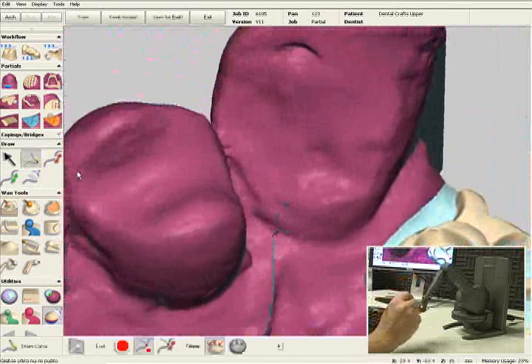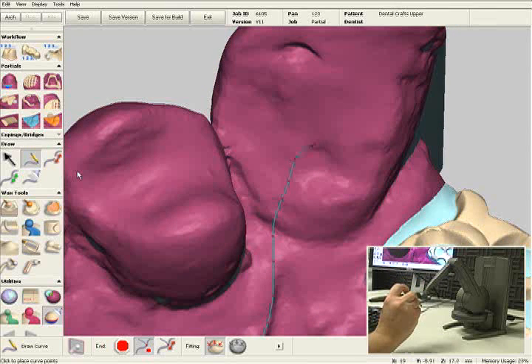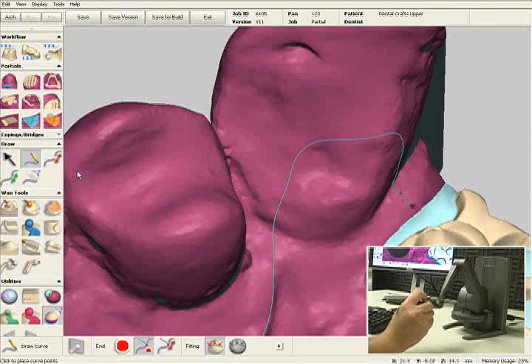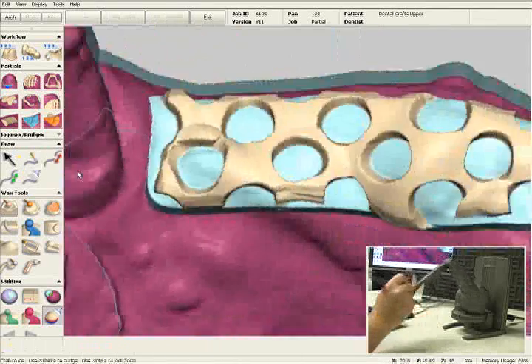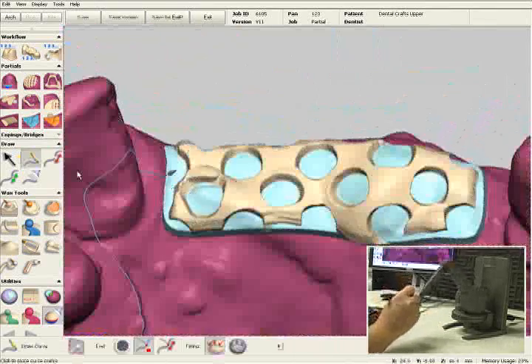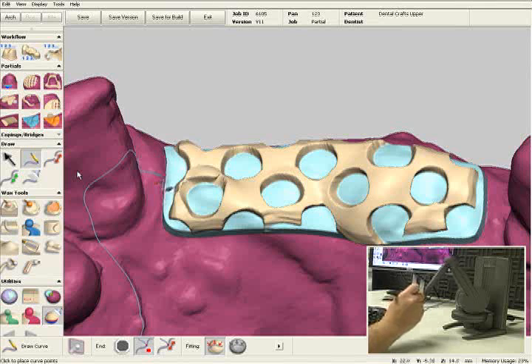I'd like to make a lingual plate right here on number 7, and I'll also create the guide plane. I'll continue outlining my major connector around the anterior mesh.